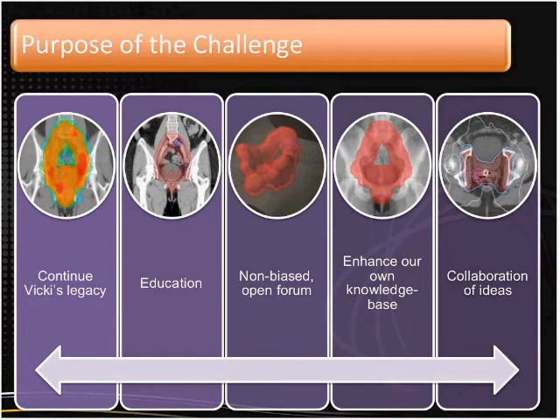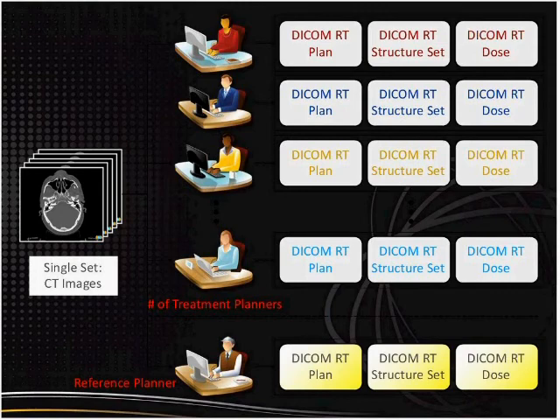And so really the offshoot of the contouring challenge came from the plan challenge itself. The plan challenge was designed to take a data set and allow dosimetrists from all over the world to collaborate on different planning ideas, to go over what most clinics feel is important to contour, how they would contour it, and then share those through some educational forums.